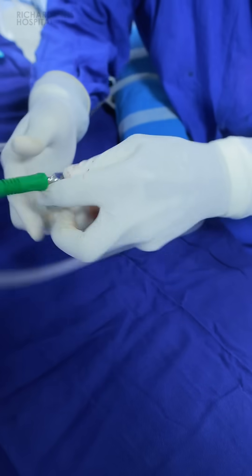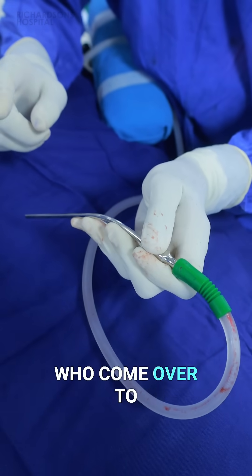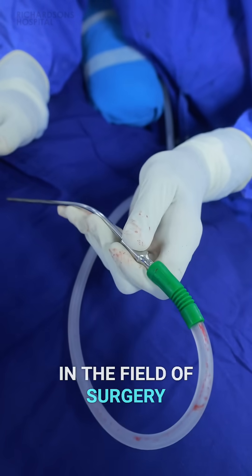This is for the left hand — right hand, left hand. This is, by the way, one of the most common things I keep telling my assistants who come to assist me, because they invariably get hold of the wrong grip, and that is actually a problem, especially when it comes in the field of surgery.